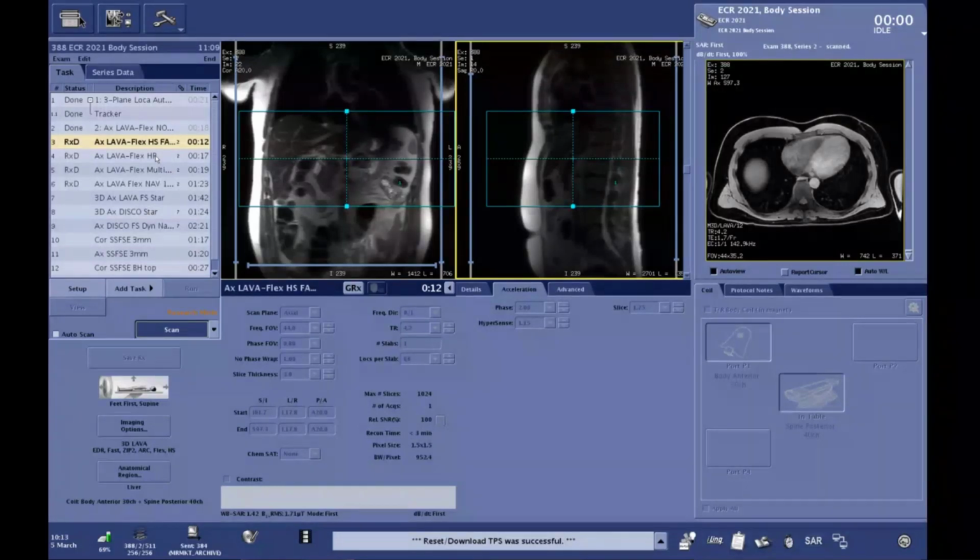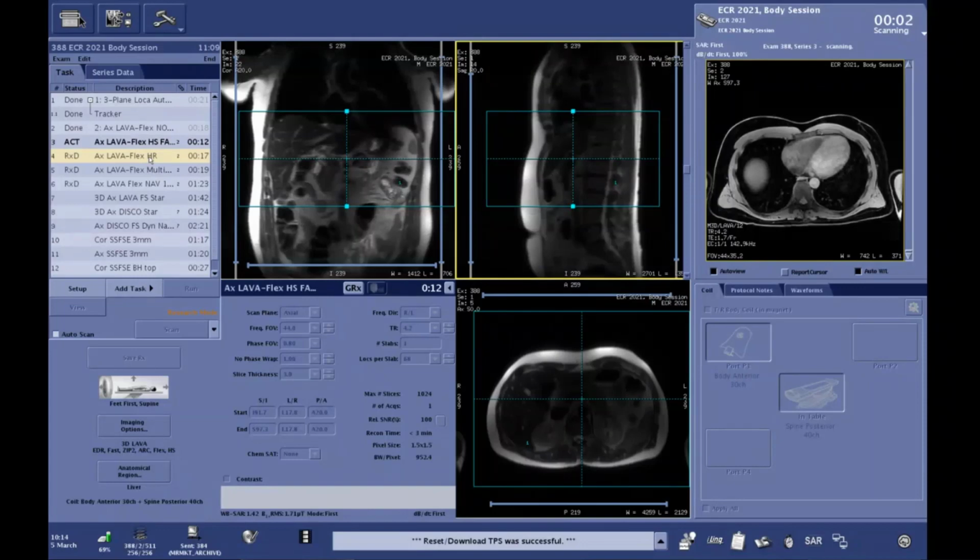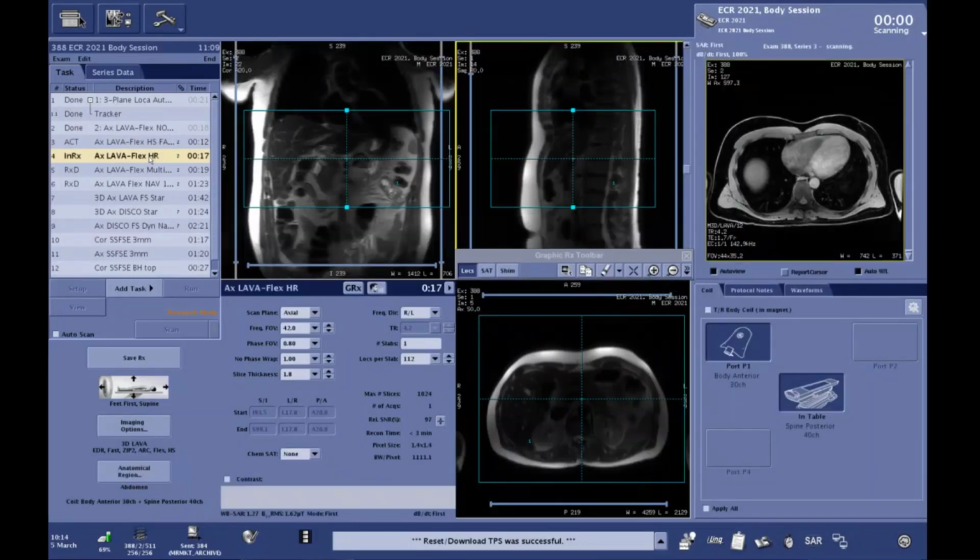Hey, Jeremy, just to also give some more details about the technique to everybody, because I don't expect everybody to be super familiar with the name of the technique from GE. I will be posting on the chat some more explanation, like what is HyperSense, what is DISCO, etc. Okay? That's perfect. That's really perfect.